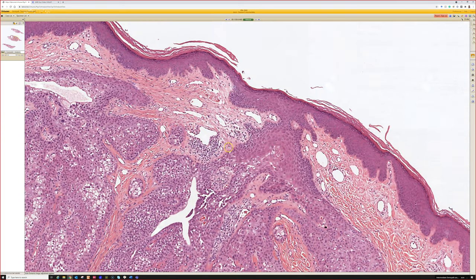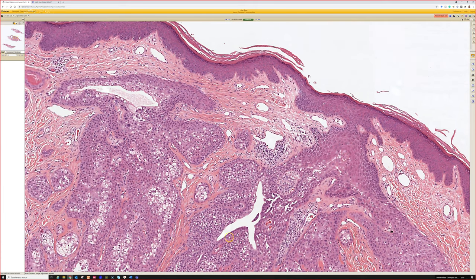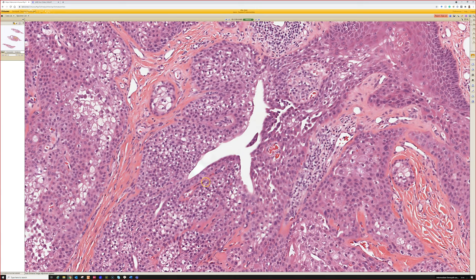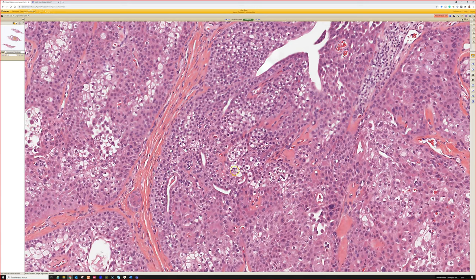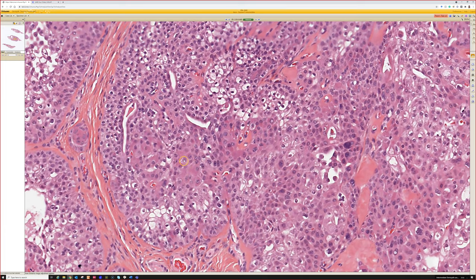Like I mentioned with the earlier case, though I didn't show it, a significant subset of the cases I've seen connect right up to the epidermis, and they can have a very similar look to poroma in that setting. Here are the duct spaces that are dilated. In this one, there's a little bit of papillary ingrowth, and that's totally fine. And then also look at the nice dramatic clear cell change, and then the other cells have very pink, abundant cytoplasm and a very keratinocyte, squamoid appearance.